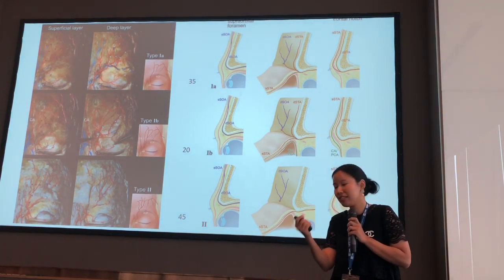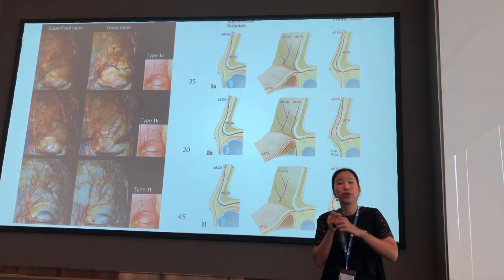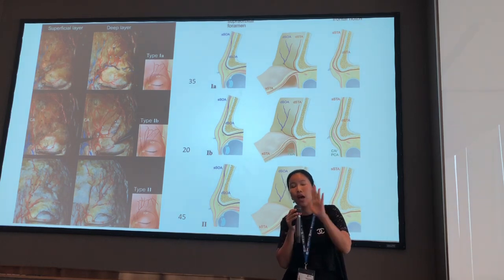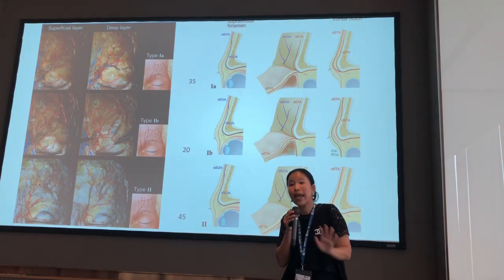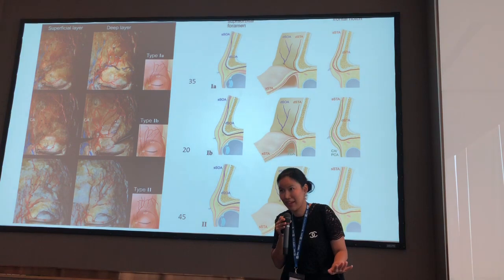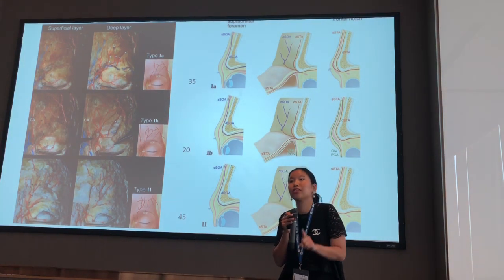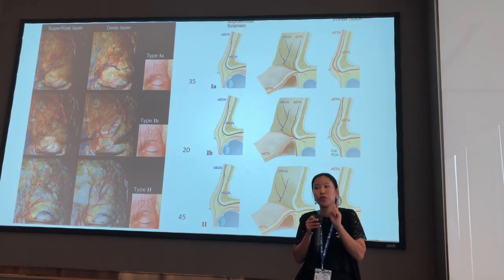I have seen the vessels there in the cadaver. However, you have to know the danger zone. Because you have good anatomy knowledge, you know where the danger zone is, and you can avoid the majority of cases. But this does not mean that you can avoid 100% of complications. Keep this in mind. So be careful every time you do an injection.